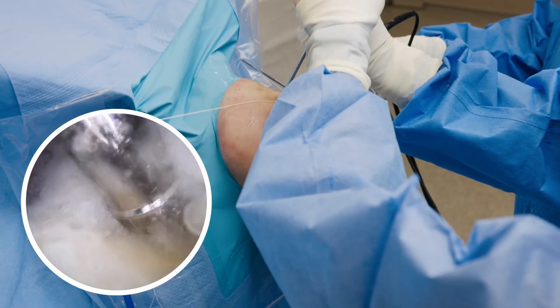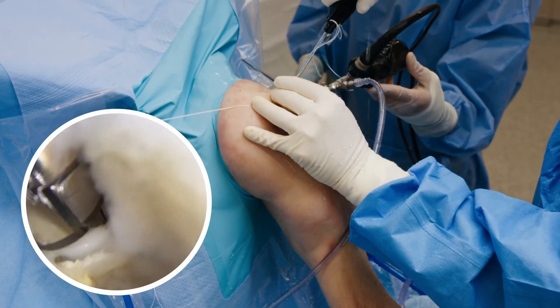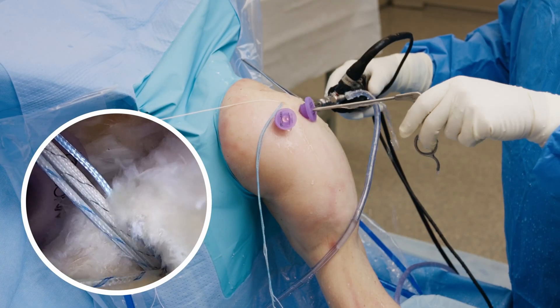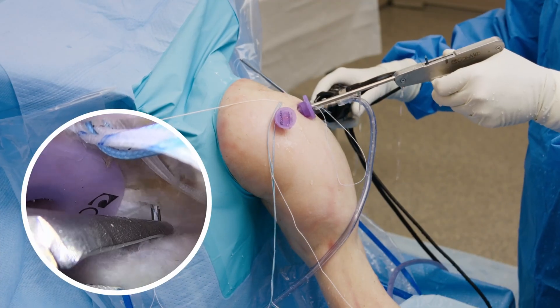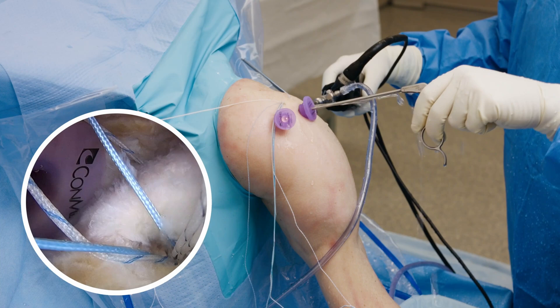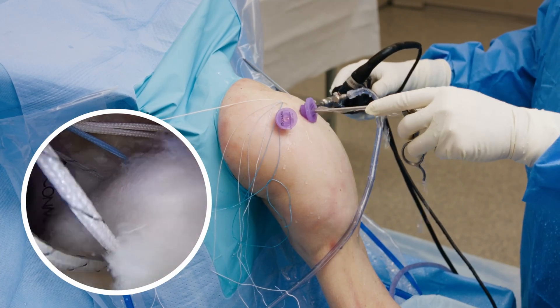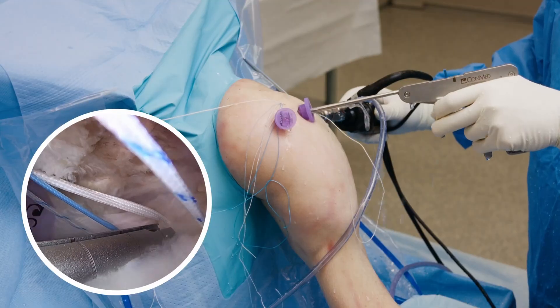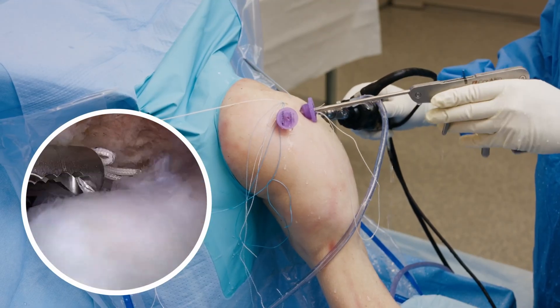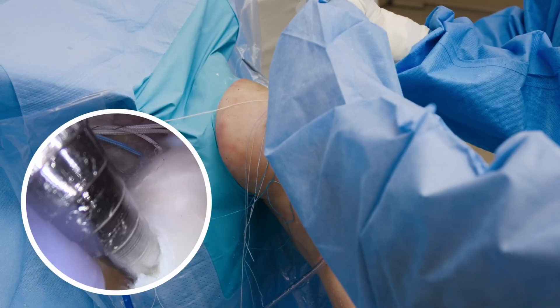We're now going to perform the primary rotator cuff repair using the CROSS-FT anchors. These are excellent anchors for rotator cuff repair fixation because they come triple loaded with multiple sutures of multiple different colors to facilitate suture management and orientation. As you can see in this arthroscopic image, we are passing these repair sutures just lateral to where we placed the medial augmentation sutures.